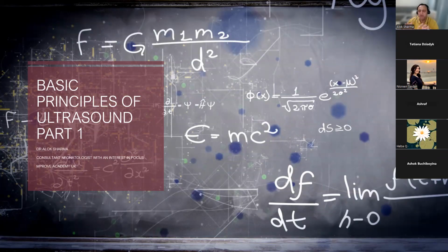Is give you a little bit about the basic overview of ultrasound physics, but this session will specifically cover ultrasound physics in relation to lung. Image generation is a kind of basic general aspect, but we need to get a feel of the physiology behind how ultrasound waves interact with tissue. And once we understand how they interact with tissue, we're then going to talk about how the ultrasound waves actually interact with lung. Because when we look at lung, we're not really looking at structure, in particular beyond the level of the pleura. What we're looking at is artifact.